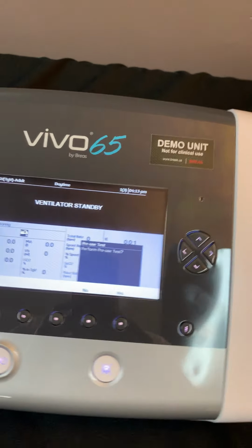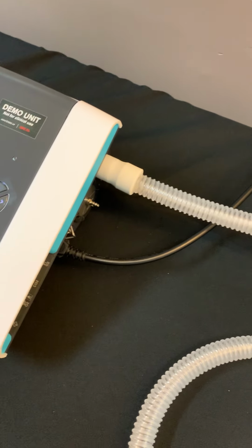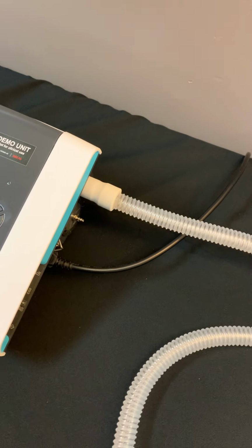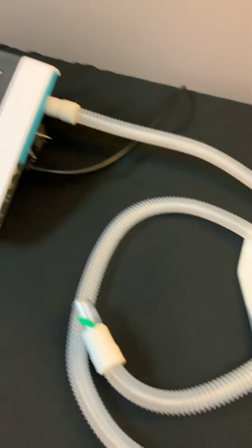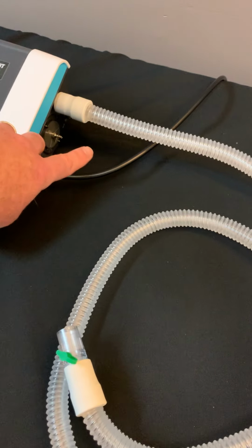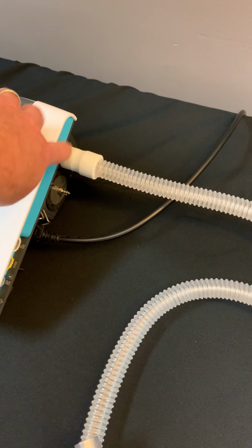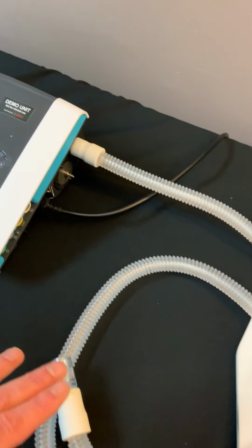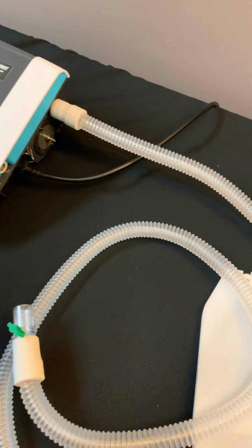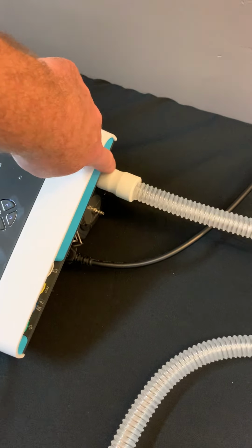Okay, so what do I mean by that? For ventilators that do not compensate for that compressible volume, let's just say you've got 400 mLs that are being delivered to the patient, okay? If you think about the 400 mLs being delivered to this test lung, the 400 is being measured, and it stops right here, okay? So once that 400 is delivered, if you're not compensating for all that volume, then the lungs never receive that 400. They receive something less than that, because the air that's in the circuit never reaches the patient, because the 400 was measured right here.